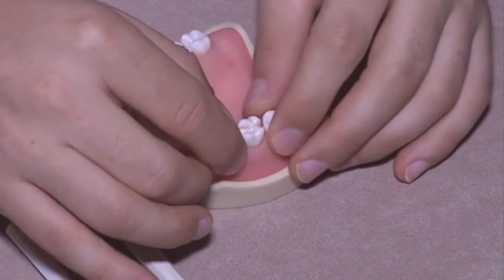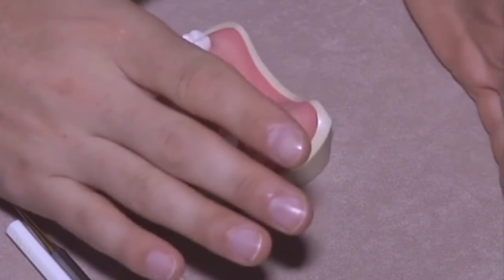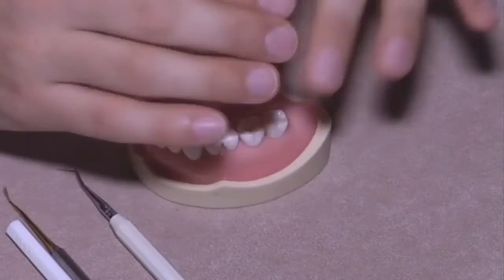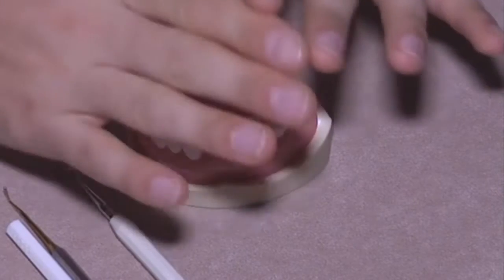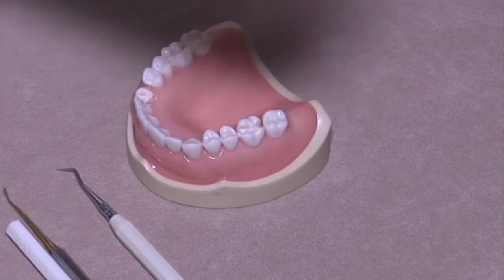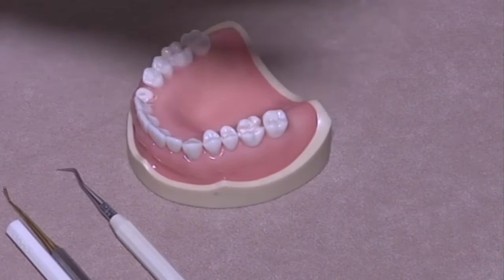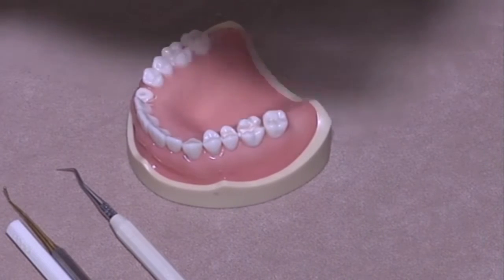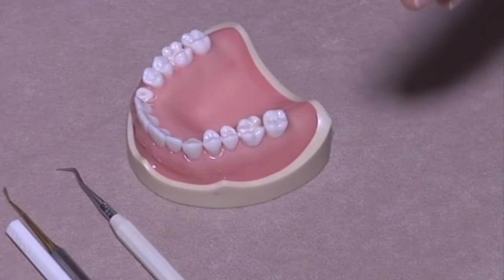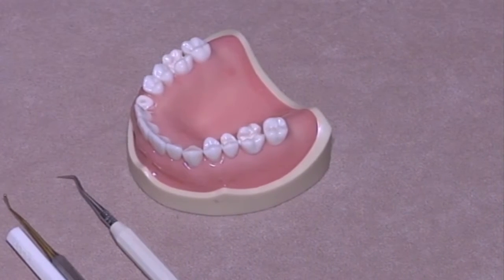About the composites, in the posterior teeth, as I told you before, aesthetics is not that much important as in anterior teeth. Aesthetics doesn't mean shape. So I pay a lot of attention in shaping and modeling the composite in order to simulate everything of a sound, real, normal tooth. So marginal crest, sulcus, fissures, triangular crest, everything. But the color is not the main problem.